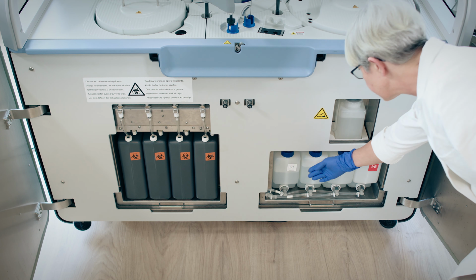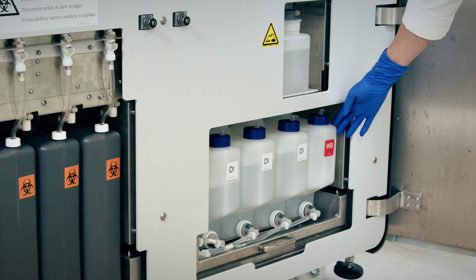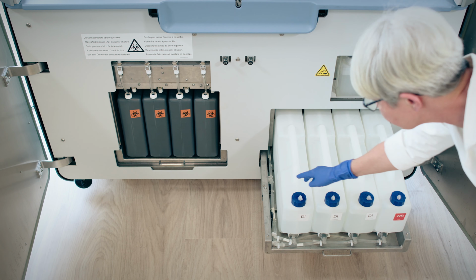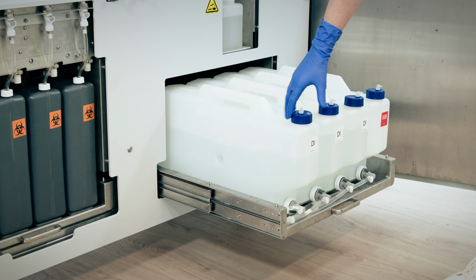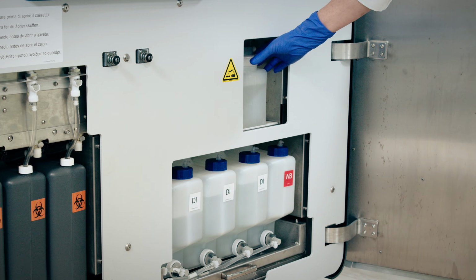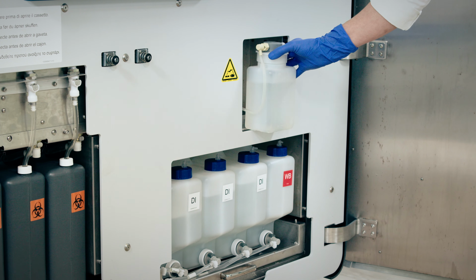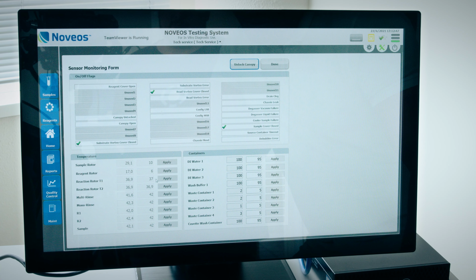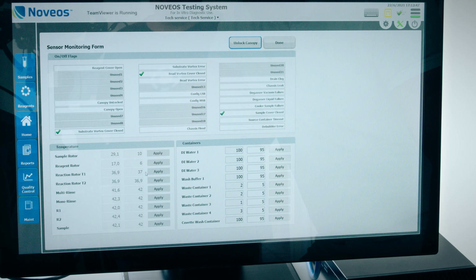On the right-hand side, you will find the source containers, 3 for deionized water and 1 for wash buffer. These containers are also placed in a drawer for easy access. To refill the containers, simply open the caps and refill by using a funnel or disconnect each container to refill outside of the instrument. The cuvette wash container is located above the DI water and wash buffer container and can easily be taken out and disconnected for refilling. All containers in the lower deck are positioned on scales which provide the information about the filling height to the instrument's monitoring device in the software.